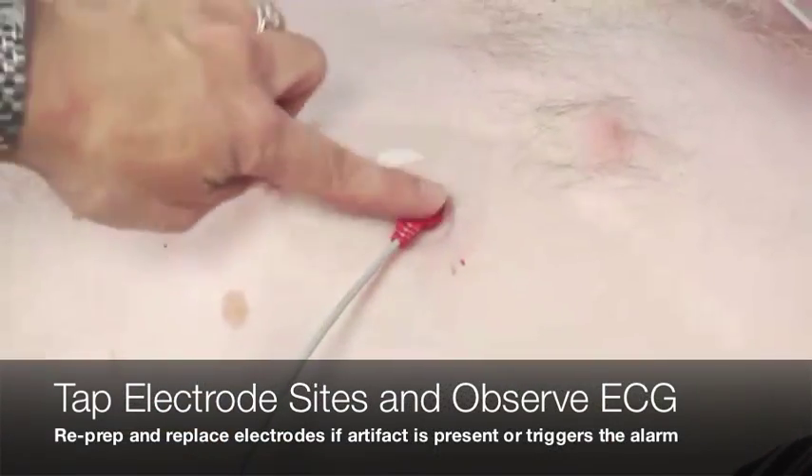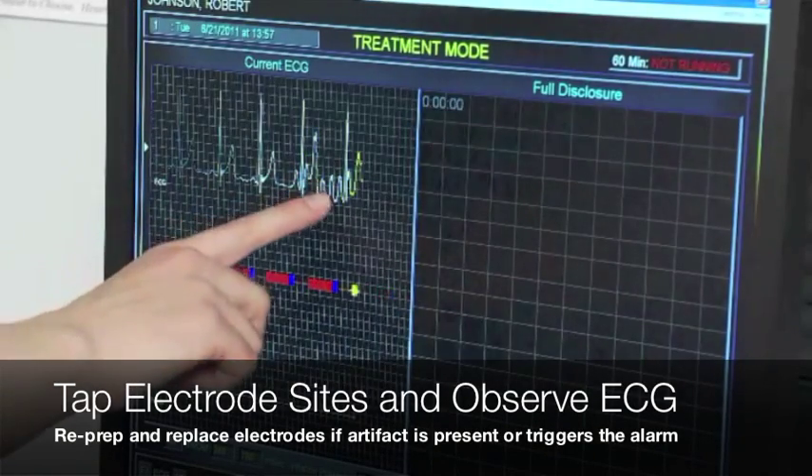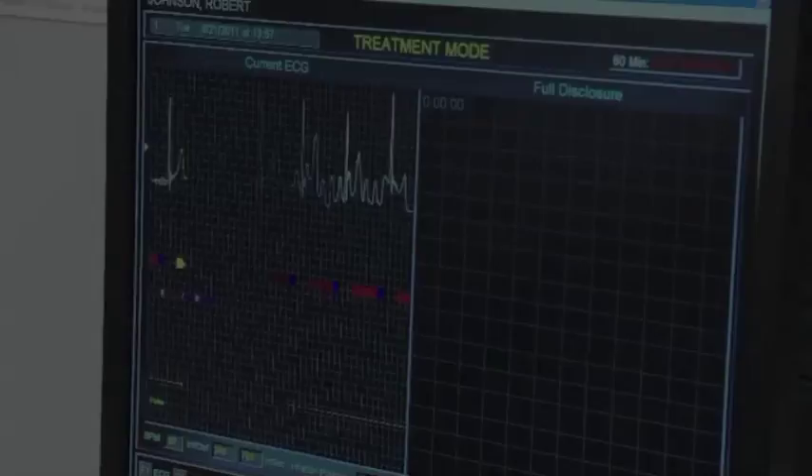Before you start, do a tap test to determine if you've done a good prep. Tap on each electrode site and observe the ECG.